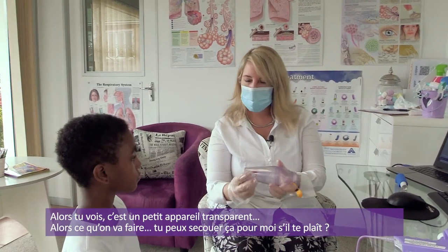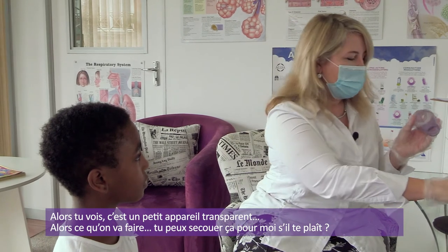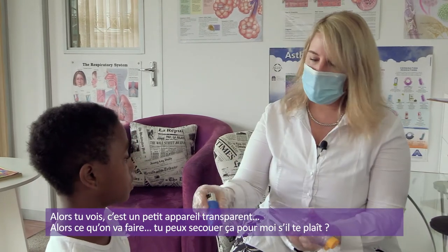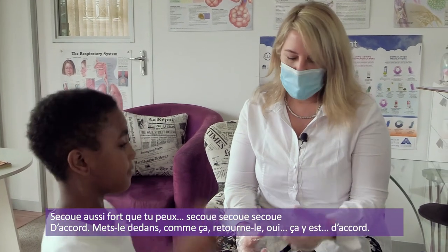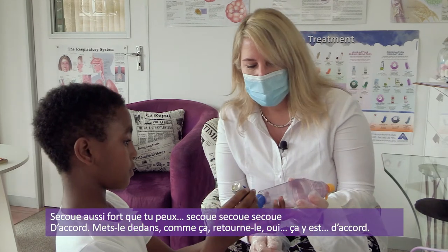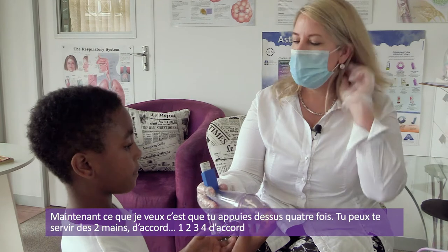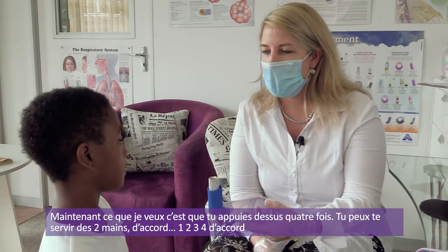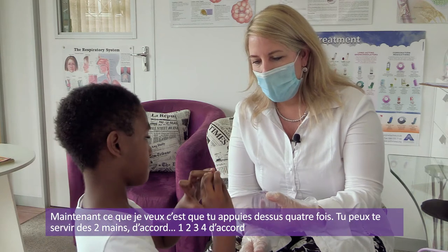Right, so you see this is a little see-through device. What we're going to do is you can shake that for me, please. Shake it as hard as you can. Shake, shake, shake, shake, shake. Good. Okay, put it in here this way. Turn it around. Yes. That's it. Okay, put it in there. Right. Now, what I want you to do is I want you to press this 4 times. You can use 2 hands if you want. That's it. Hard.